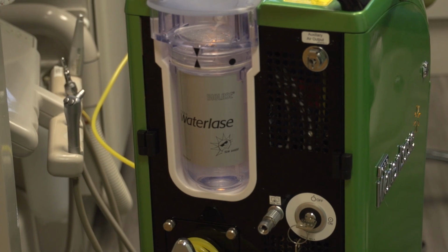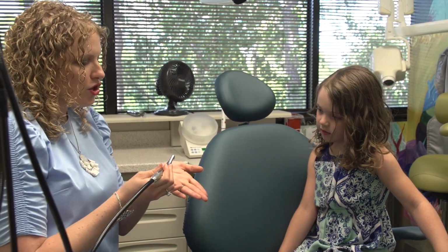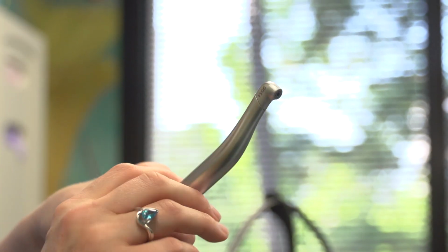the point where I would be giving them local anesthetic. And then at that point, instead of using this little fluid that goes in and works with the nerves to help the kiddo not feel sensation, I get to pick up my great laser. And when I aim my laser at the tooth, what it does is it works with the nerves underneath the tooth. And it's very focused, so meaning that I can just numb, and it does it again just under the spot where I'm pointing the laser.